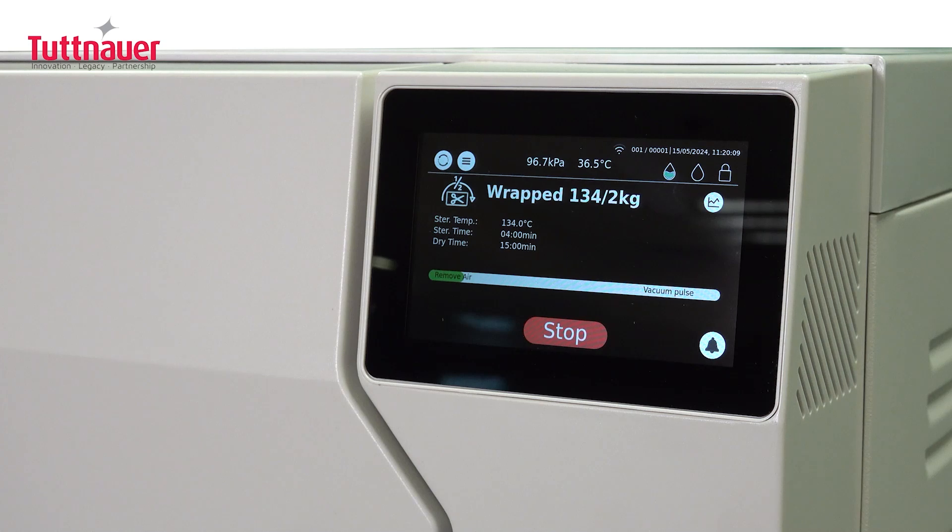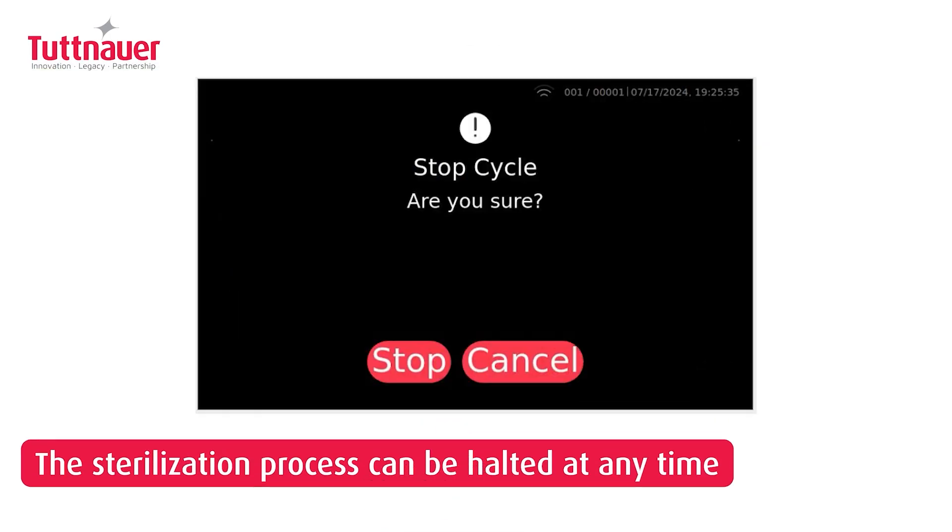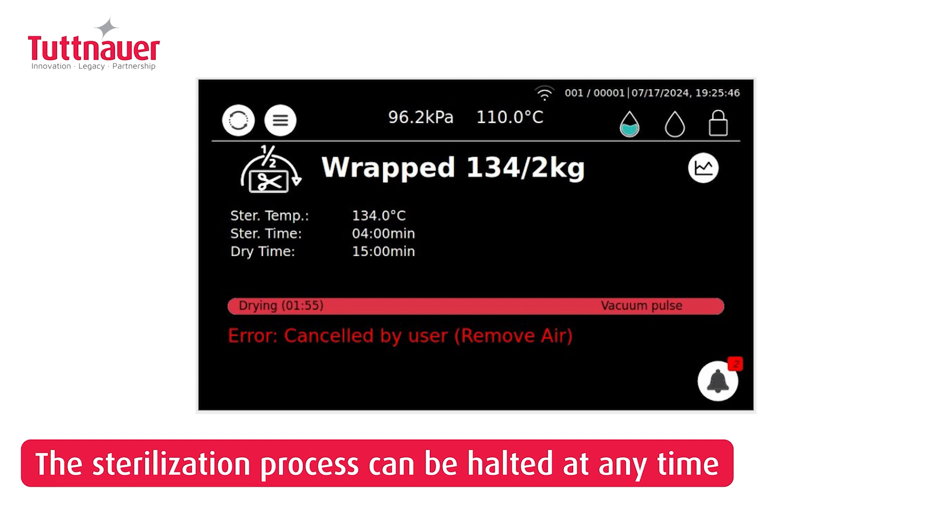Track the program's progress and time remaining through the display, with options for numerical or graphical view. You can stop the cycle anytime. The chamber needs about two minutes to cool down and release steam safely before opening.